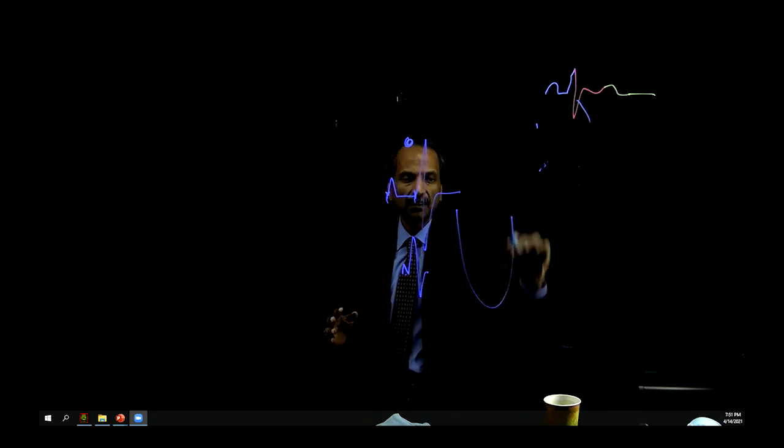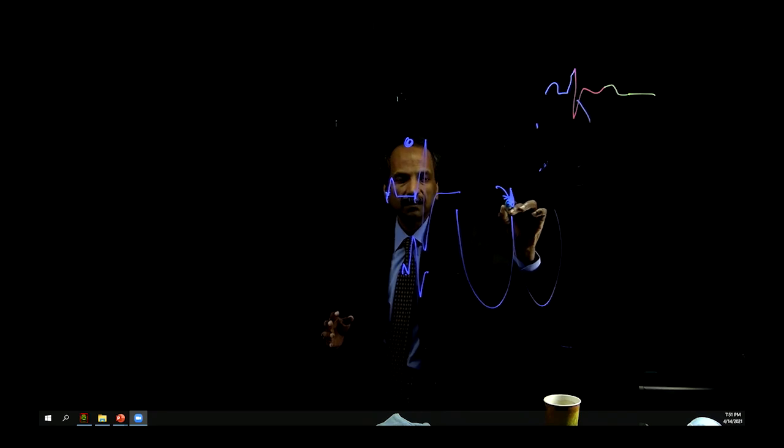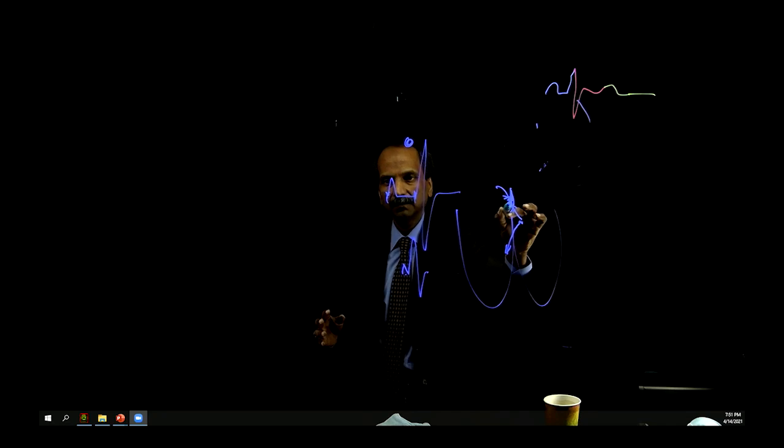But if that His to V is shorter, it doesn't matter that the His is before the V, it is not a supraventricular arrhythmia. It's something that's originating below the conduction system at the recording site. So if the recording site is here, but the arrhythmia is here, you may get to the V relatively earlier than you do from that recording His.